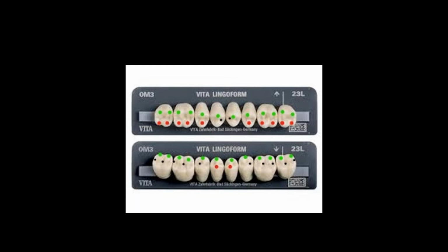Functional teeth. They're all milling teeth, so there's contact from the buccal to the lingual and the mesial to the distal through the whole tooth, where here we just have that red dot cusp touching into the fossa of the lower. These are more mortar and pestle. So this function is going to be more efficient.